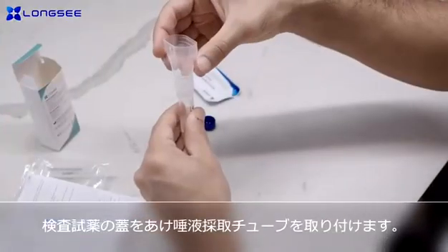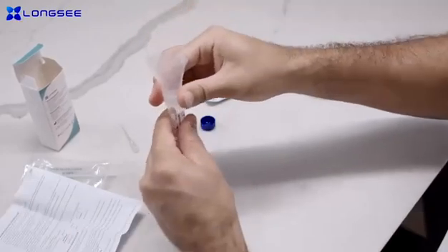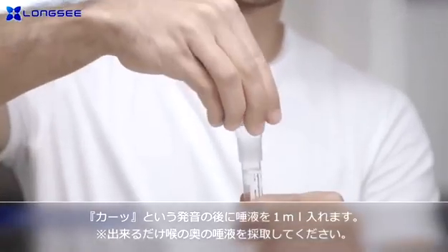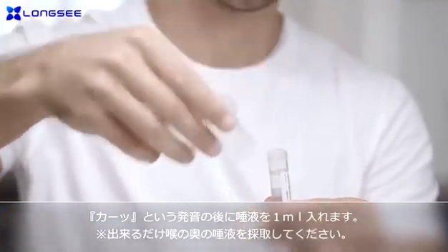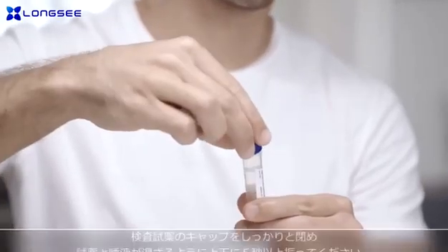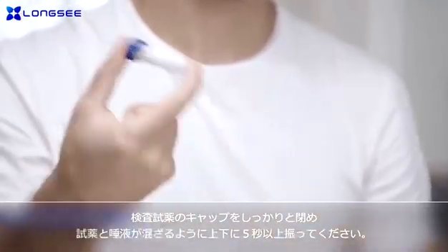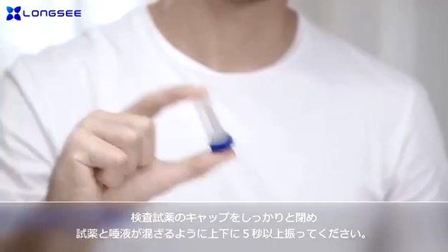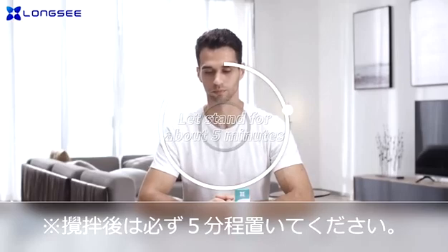Take out the saliva collector and take around one milliliter of saliva. After the collection, unscrew the funnel and screw the blue nozzle into the collection tube. Turn upside down the collection tube slightly for five seconds, ten times. Leave the collection tube to stand for about five minutes for the saliva and buffer to thoroughly mix.